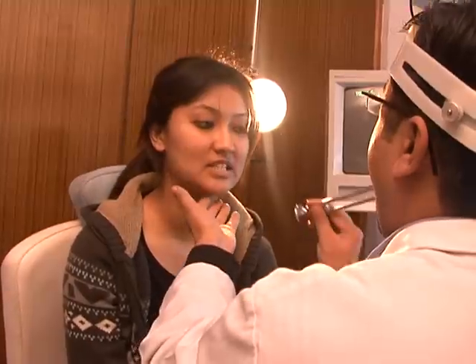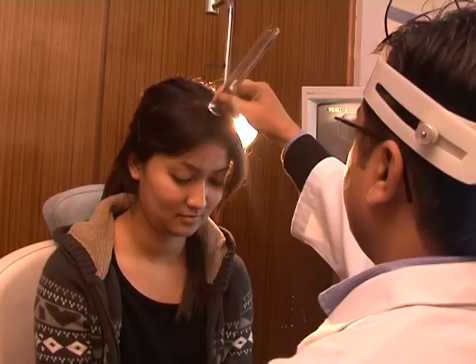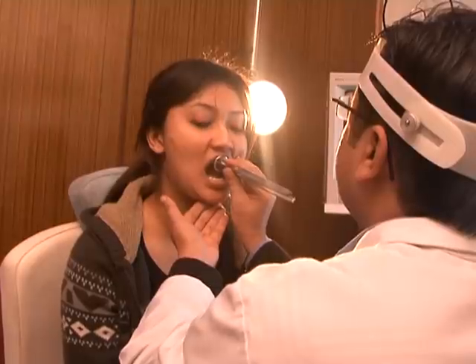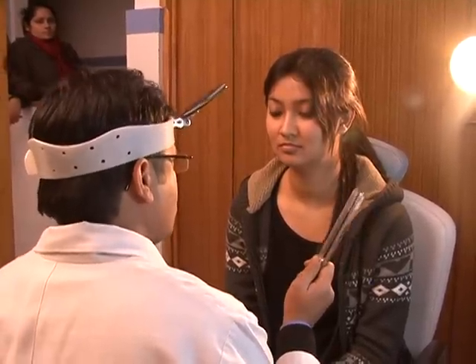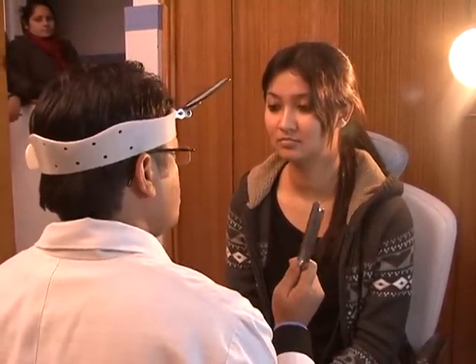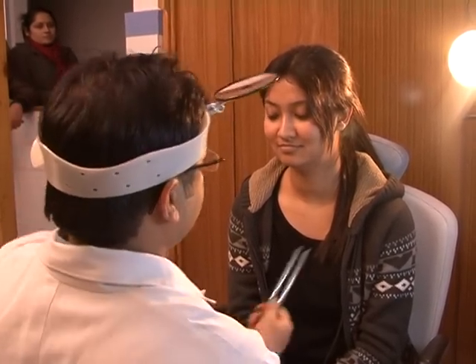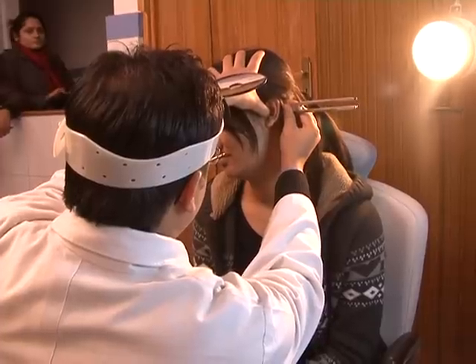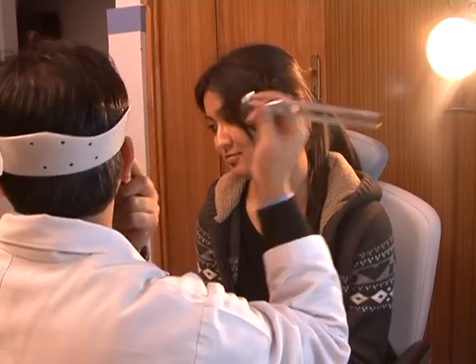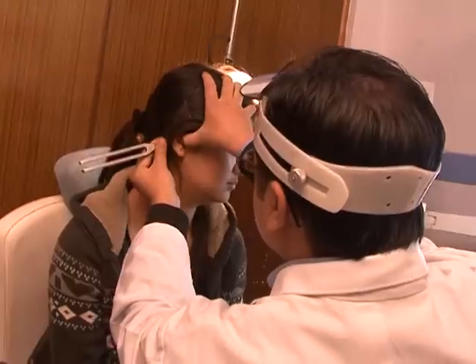In Weber's test, a vibrating tuning fork is placed on the centre of the forehead, the vertex, or on the upper incisors, and the patient is asked about lateralization of the vibration. The ABC (Absolute Bone Conduction) test is done by occluding the patient's ear and placing the vibrating tuning fork on the mastoid tip. Once the patient stops hearing it, it is placed on the mastoid tip of the examiner (with their canal occluded) and the reading is interpreted accordingly.